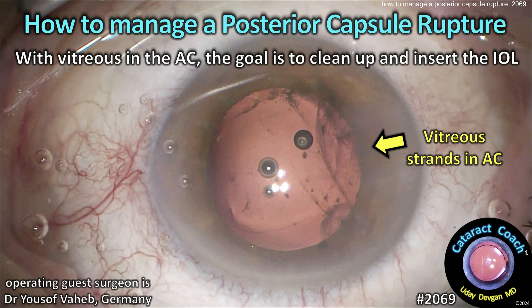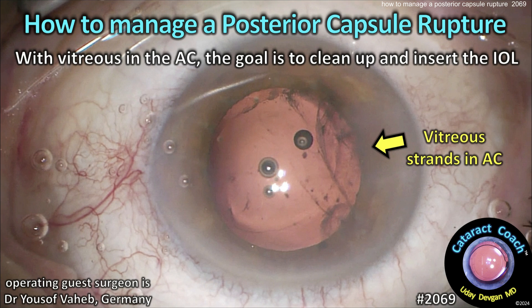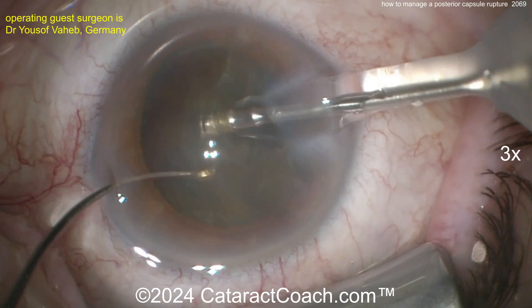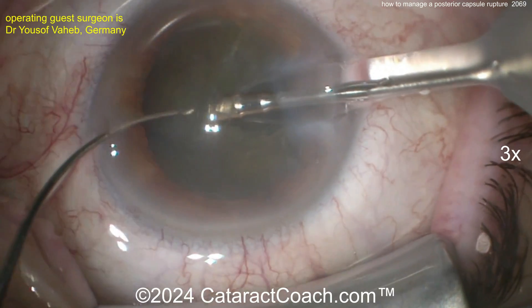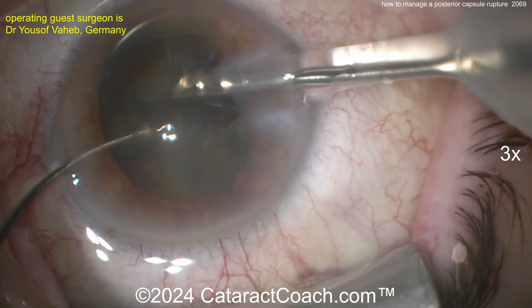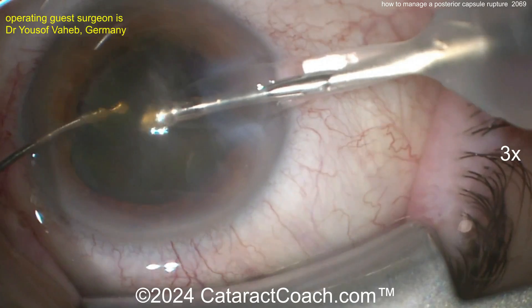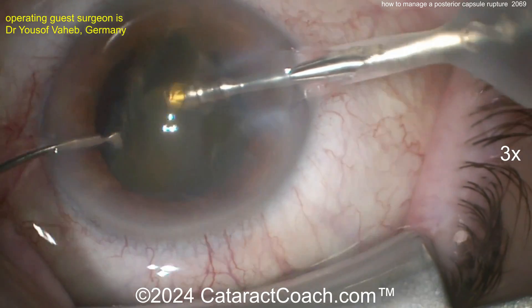cataractcoach.com: how to manage a posterior capsule rupture with vitreous in the anterior chamber. The goal is to clean it up and insert the IOL. Here's a patient having a routine cataract case — let's watch what happens.